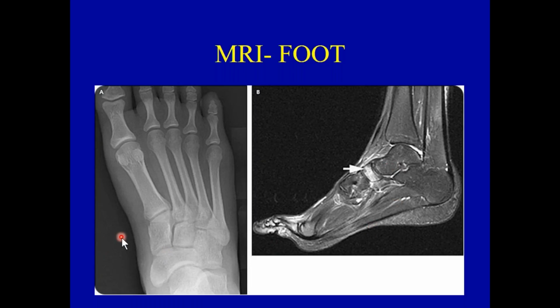So your good AP foot examination was very, very helpful. If that goes to the MR center, they can say, well, it was a negative plain film examination. What do I have to make a decision on? Runner, pain in the navicular for 4 to 6 weeks or even longer. One of the things that it could be is a stress fracture, and the MRI proved that beyond any shadow of a doubt.